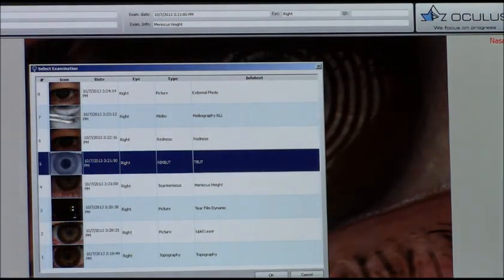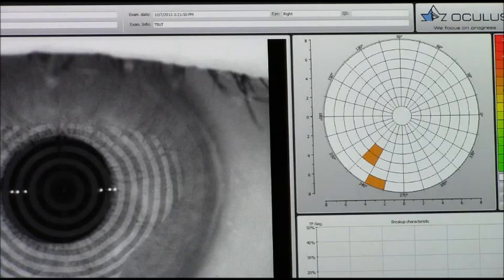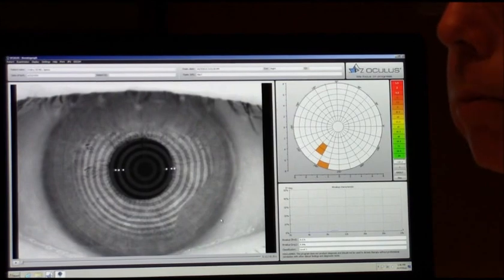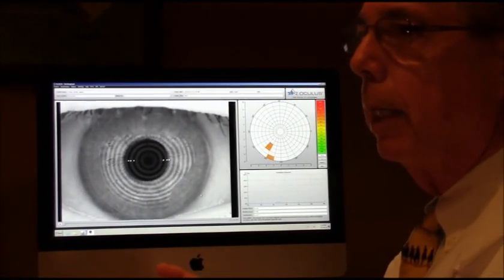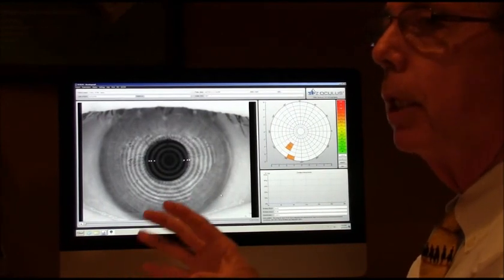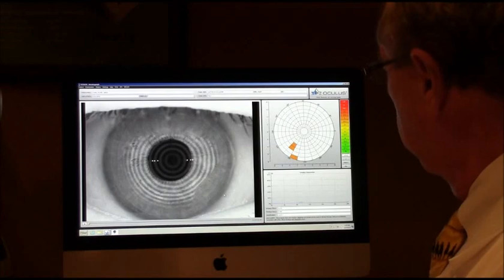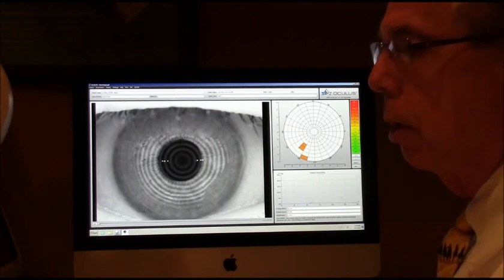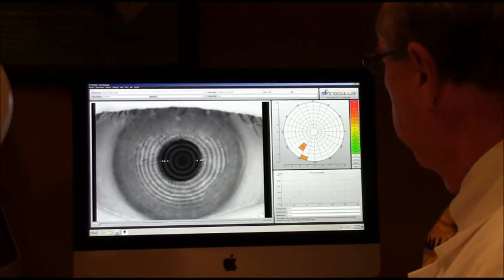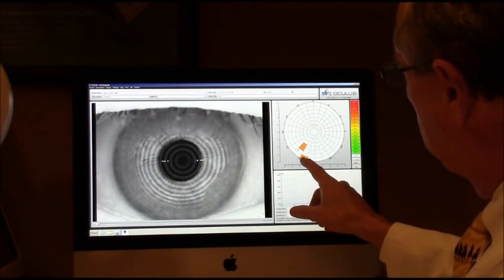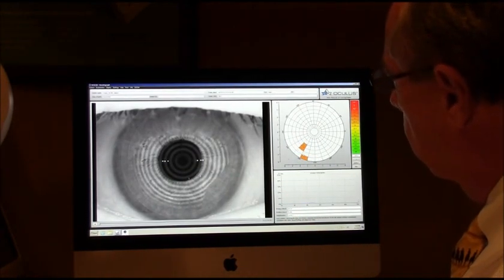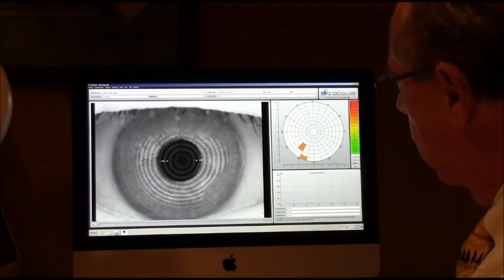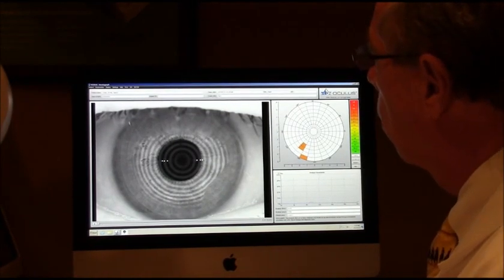Then we look at tear breakup time. The machine has the patient blink a couple of times, then holds still, and counts how many seconds it takes before the tear film breaks apart. This result was 8.6 seconds, which is also at the lower limit of normal. It also tells us exactly where on the cornea the tear film started to break apart — it watches these rings, and wherever they start to fall apart, it stops the timer and records the location.